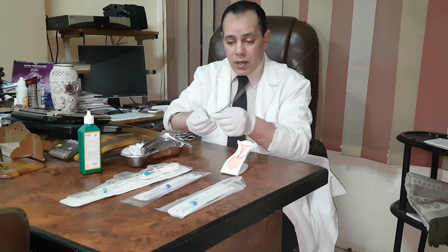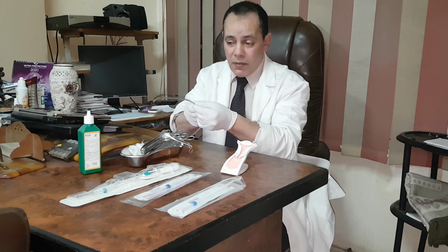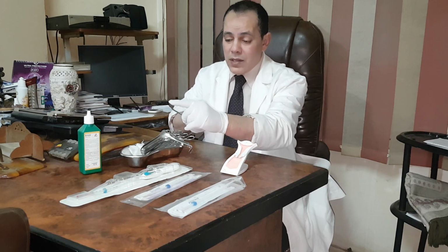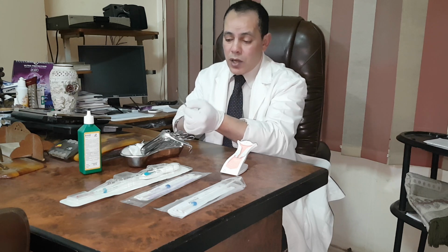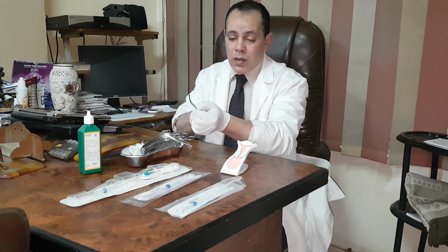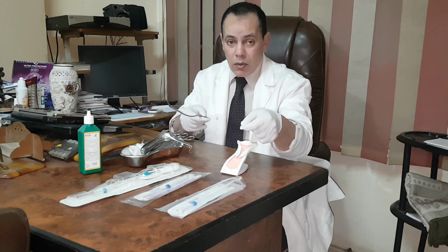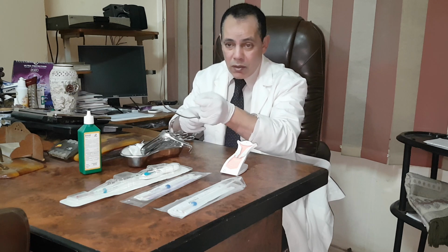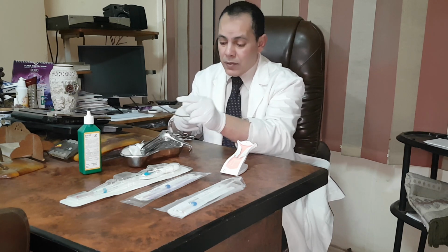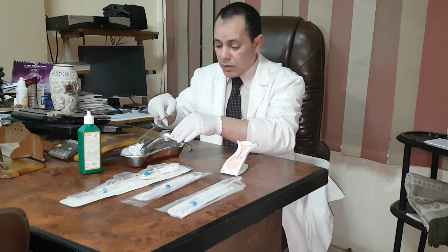to know the direction of the uterus, is it AVF or RVF, and to know the length of the uterine cavity. Then I measure it because during insertion of the tube carrying the IUD, I want to insert it to a certain length. So I know the length of the uterus from the uterine sound.